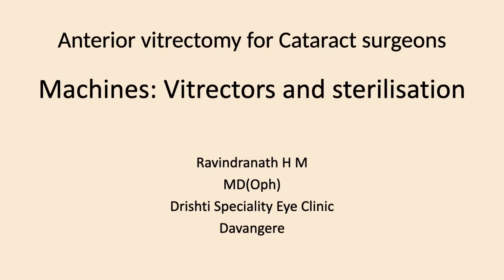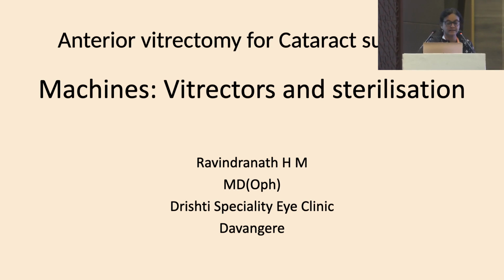Without any delay, we'll start the IC now. Since Dr. H.M. Ravindranath has not joined us, I'll be speaking on his topic. His topic is anterior vitrectomy for cataract surgeons, the vitrectors and sterilization.